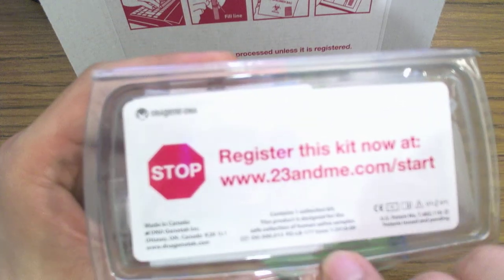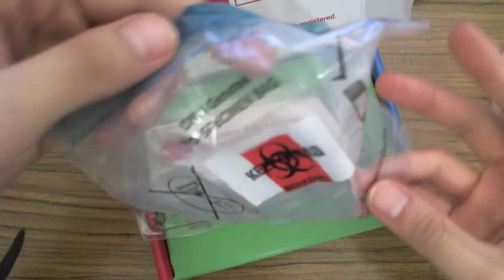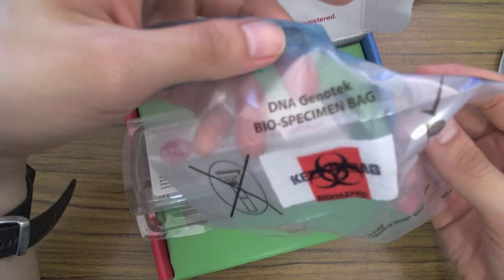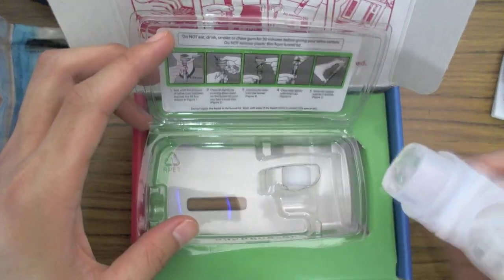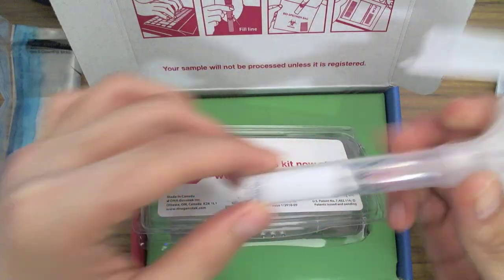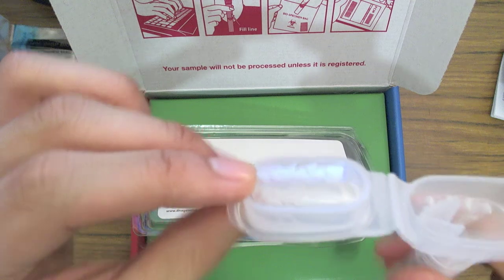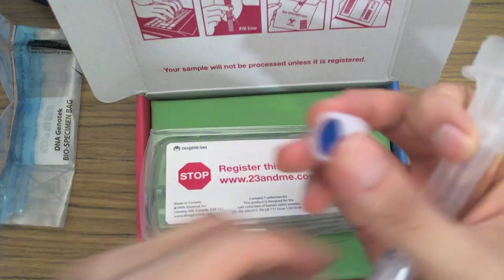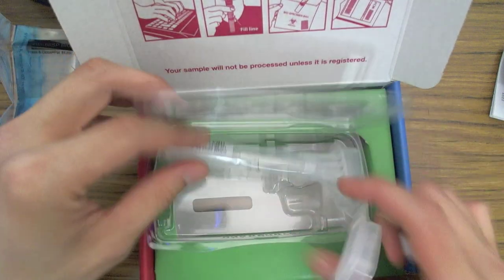This kit contains one — I guess we'll call it a spittoon. In the box you have the bag in which to place the specimen — it says DNA Genotech Biospecimen bag. Biohazard — I guess spit is pretty dangerous. So what you do is spit in here and fill it up to this line right here, then close it. I'm not sure what this liquid is inside, and I'm not sure where this other part goes, but I'll figure it out soon enough. In any case, that is the spittoon.